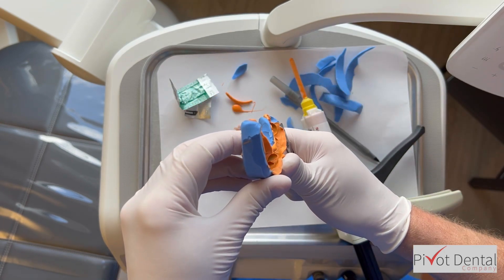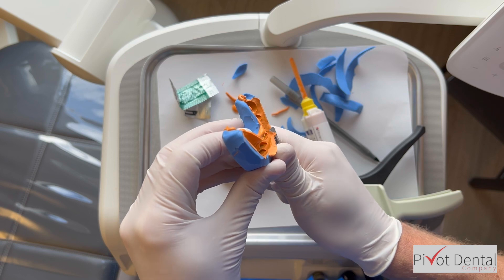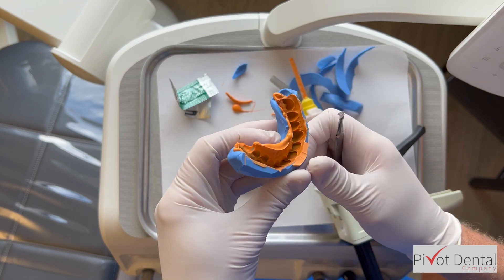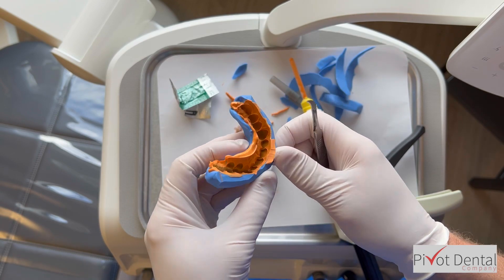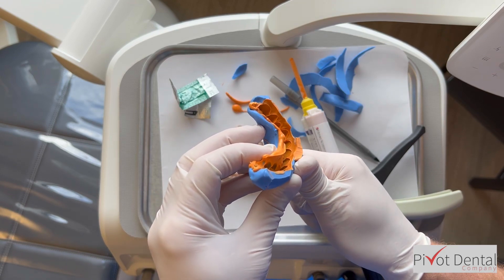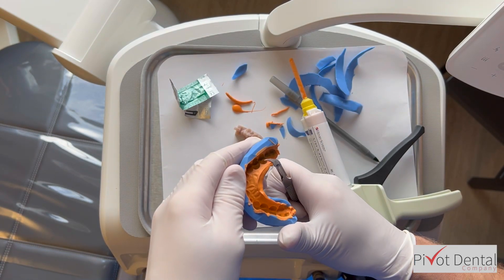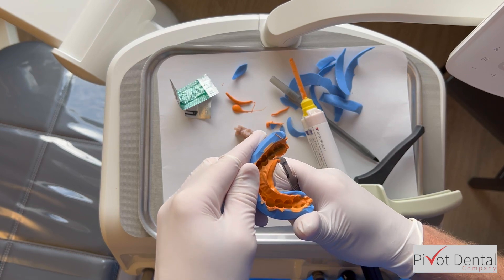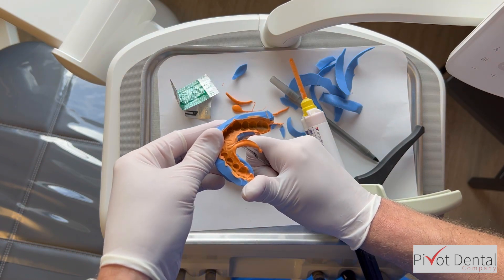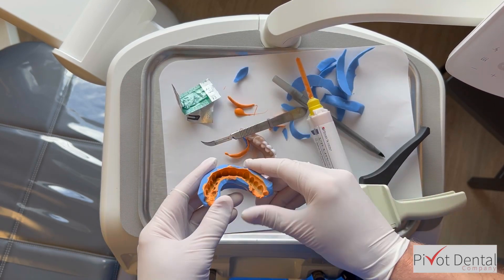When we go to the patient's mouth, we have this wax-up and can make really nice temporaries with minimal trimming and cleanup. I always use what I call a shrink-wrap or single-step temporary material technique where we actually bond the temporaries onto the teeth — I have other videos covering that technique. The patients don't have to worry about these things falling off, which is great. The downside is you have to cut them off at the next appointment, but it's a small price to pay for a happy patient. Well-fit temporaries are very important and this wax-up gives the patient a preview of what their smile will look like.